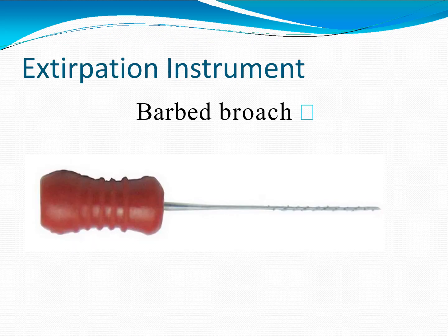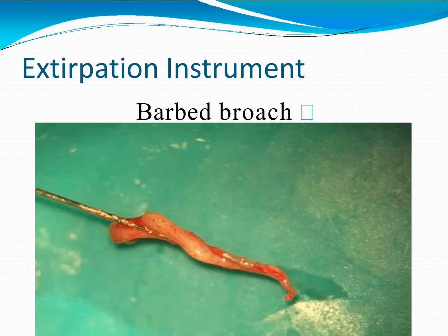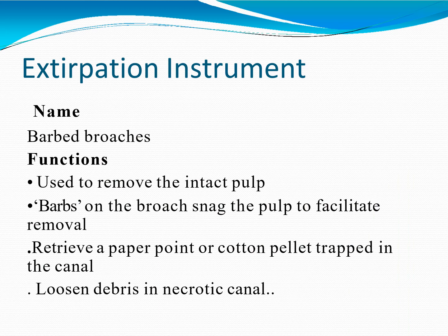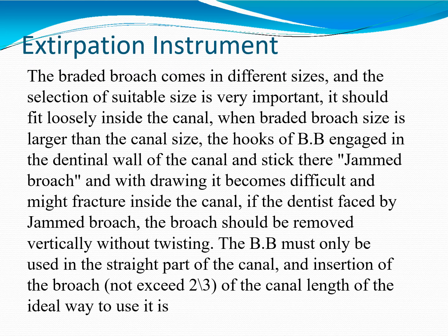The barbed broach is an extirpation instrument used to remove the intact pulp — it should fit loosely inside the canal. The barbs on the broach snag the pulp to facilitate removal. It can also retrieve a paper point or cotton pellet trapped in the canal, and loosen debris in a necrotic canal. The barbed broach comes in different sizes and selection of a suitable size is very important.